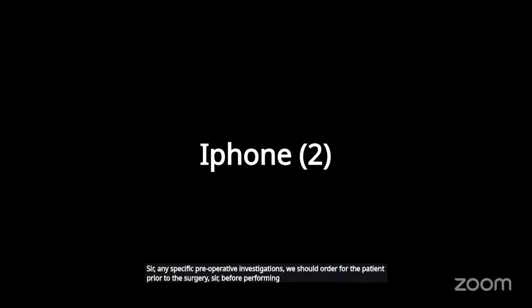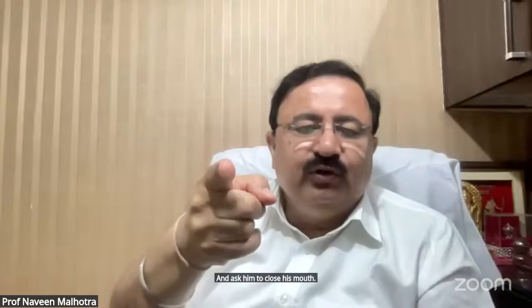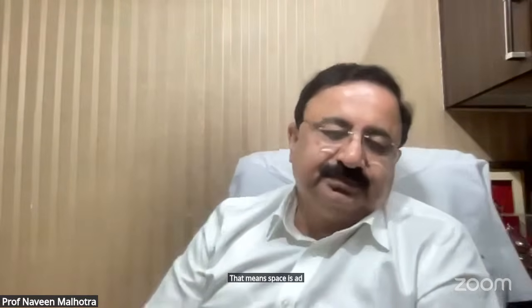Sir, any specific preoperative investigations we should order for the patient prior to the surgery, before performing submental intubation, sir? See, routinely, most of the things would have been done, but absolutely no specific investigation is required. If you're doing retromolar, put your own finger, a gloved finger, into the patient's retromolar space and ask him to close his mouth. If there is no pressure on your gloved finger, that means space is adequate.